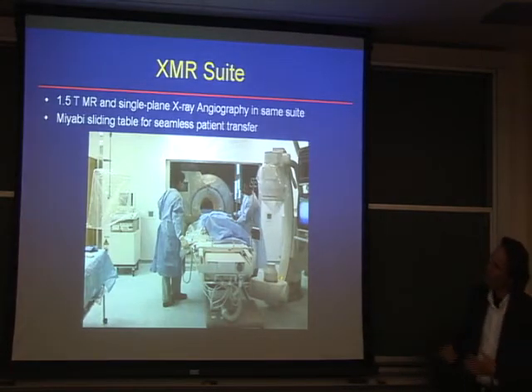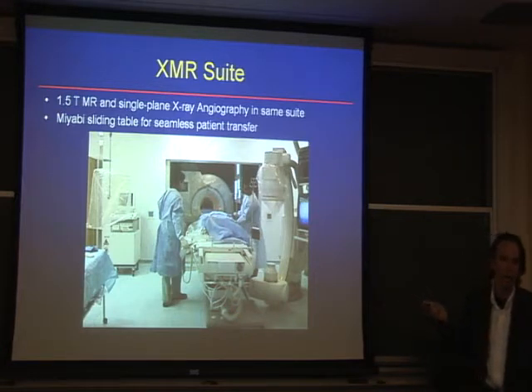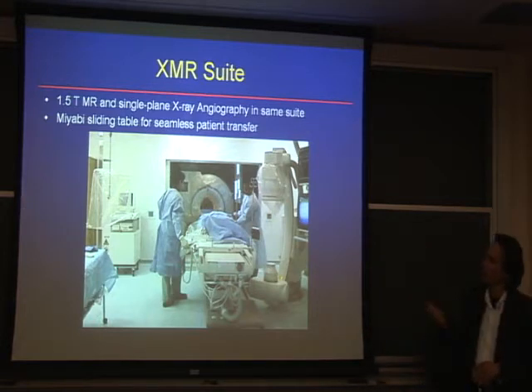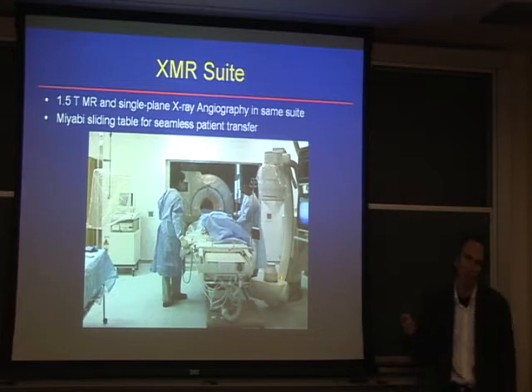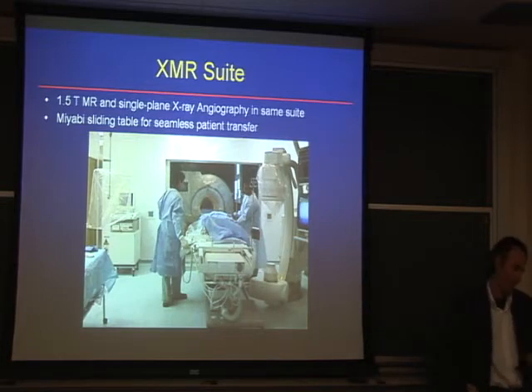In the early days of developing interventional MR, here's a Sonata, a Siemens kitted up hospital. We have 2 of these interventional labs. We have the standard fluoro system and the table on which the patient sits on rails. You can go straight up to the scanner, and you can move the patient between the MR and the X-ray. There are certain procedures that you can partially do under MR, but certain devices only work under X-ray. Also, the interventional cardiologists want some kind of emergency egress situation. If things go wrong here, they can just come back out into the X-ray part and all their devices work. Naturally, some devices, specifically catheters with a stainless steel braid, do not work at all in MR. You bring them into the magnet and they straighten up, and when you let go, they fly into the magnet.